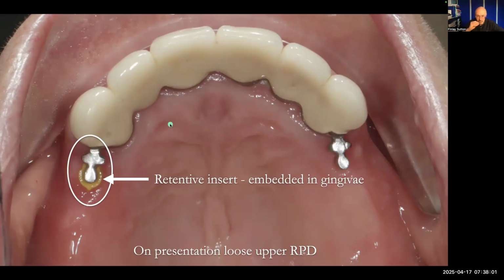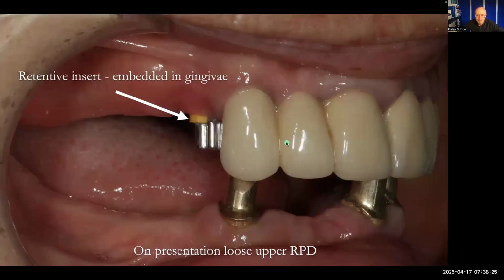It's always good to have it double abutted because they will pull on that distal abutment and cause a complete breakdown of attachment of these teeth. So having them at least double abutted is super important, although I really don't like them just because of the complications that can occur with them.